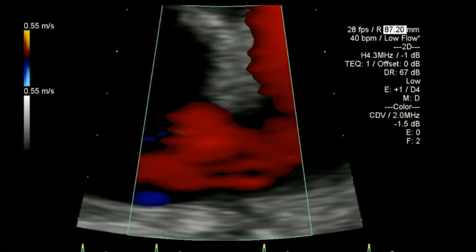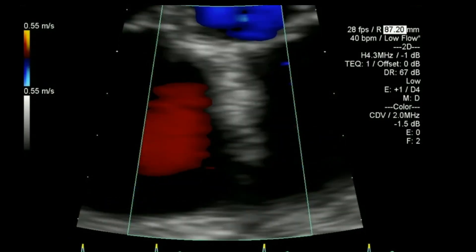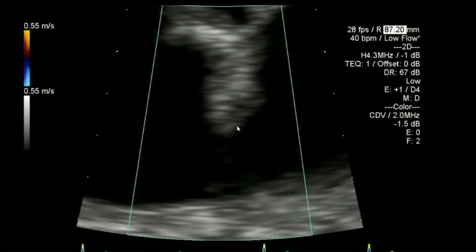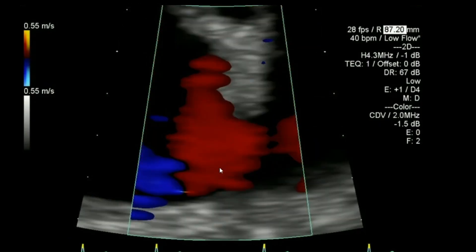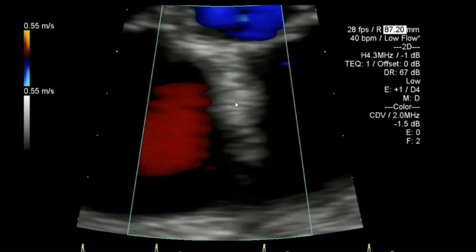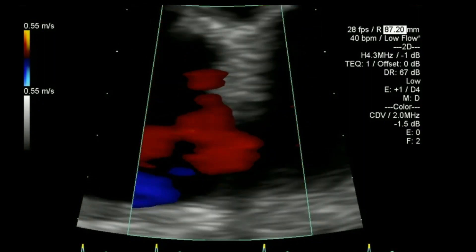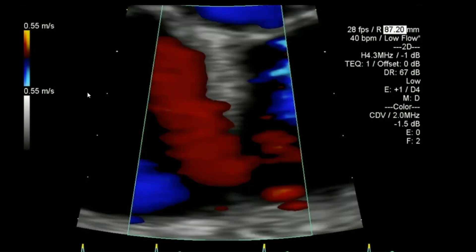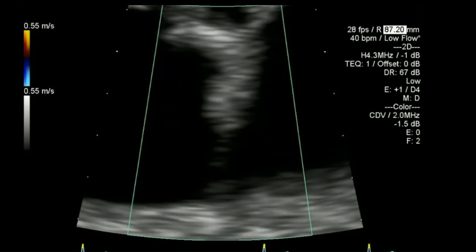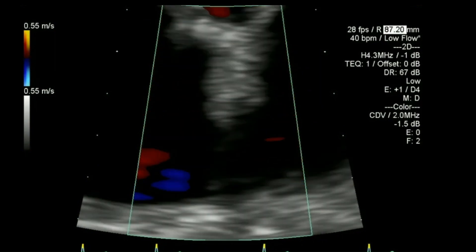Here I'll zoom on the atrial septum again just to look for colour flow — any flow going across. Similarly I've got my colour scale down to visualise that.